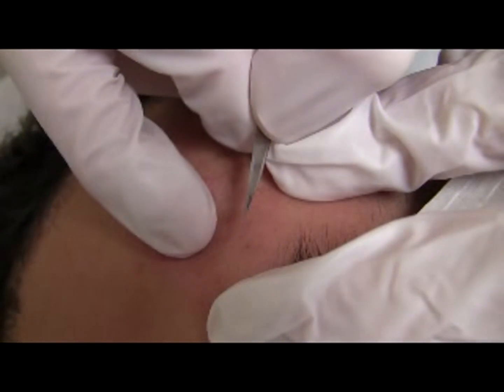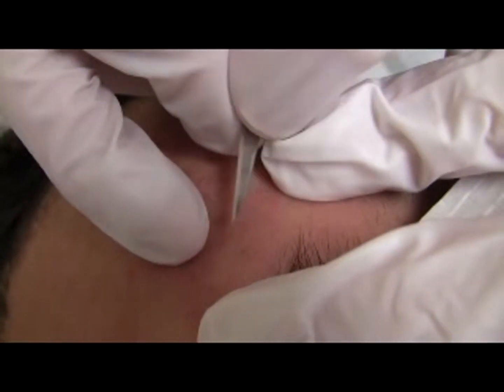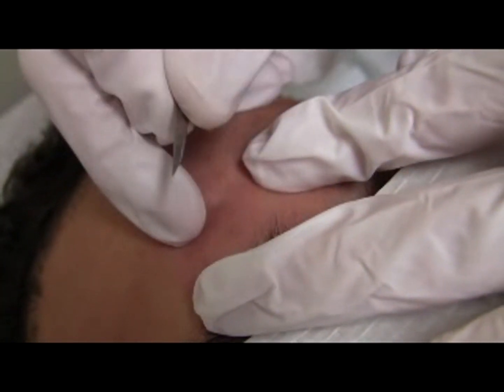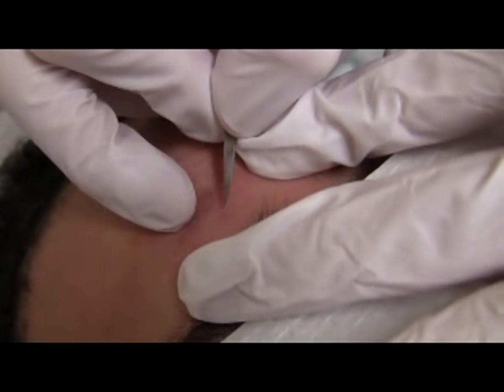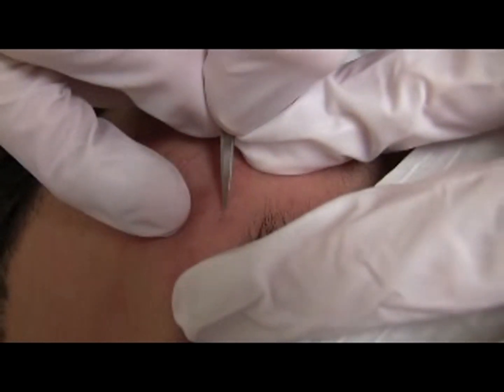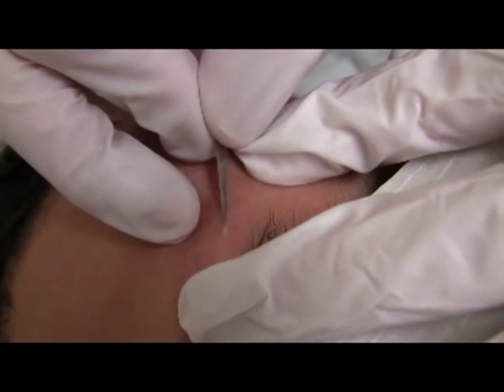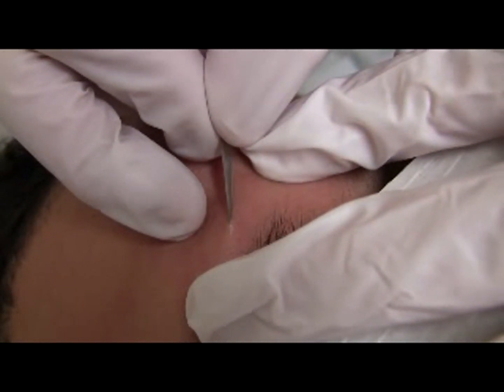Much like the intralesional injection, pull the left index toward you and insert the 11 blade at the base of the lesion. My left index is pulling towards me and the blade is being inserted to the base of the lesion. Advance it parallel to the skin, directly opposite the direction you are pulling with the left index finger.